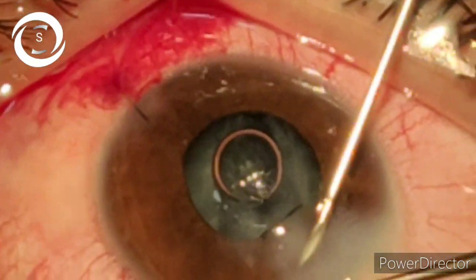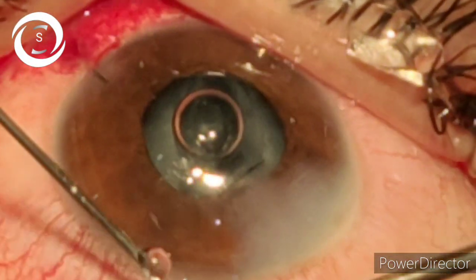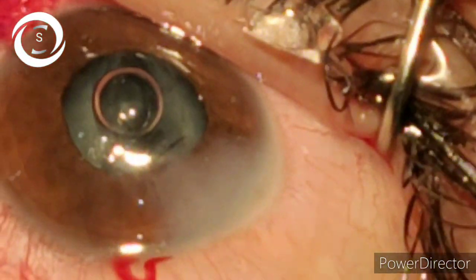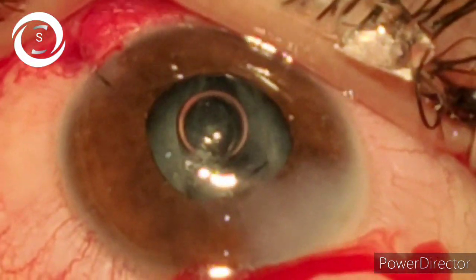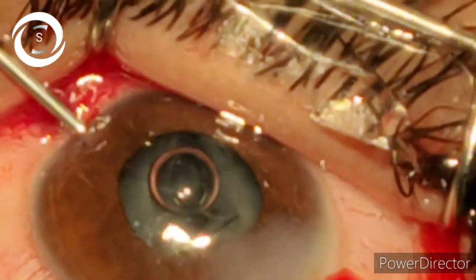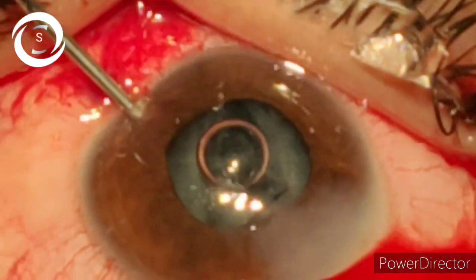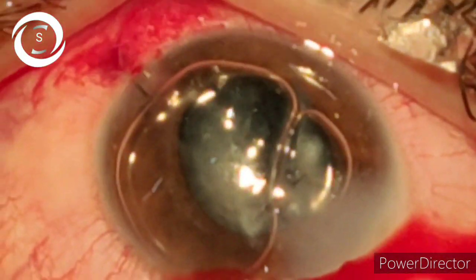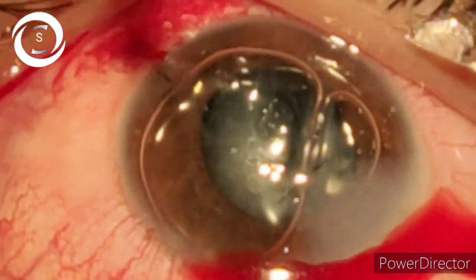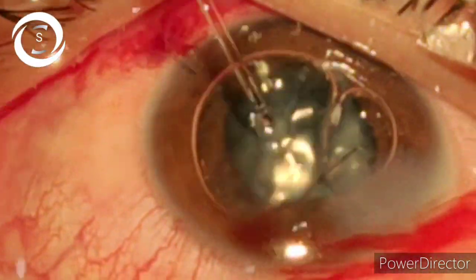The patient has a ruptured anterior capsule. Later on, when the corneal wound completely seals and the infection subsides, we will then proceed towards cataract surgery — traumatic cataract irrigation and aspiration with foldable IOL implant. We could do it in a primary setting, but as the cornea was perforated, keratometry was not able to give us correct readings. That's why we decided to do it in two steps: first step corneal tear repair, and second step cataract surgery.